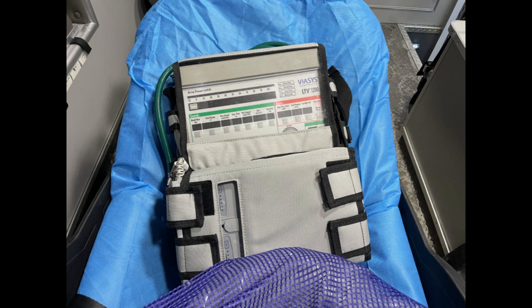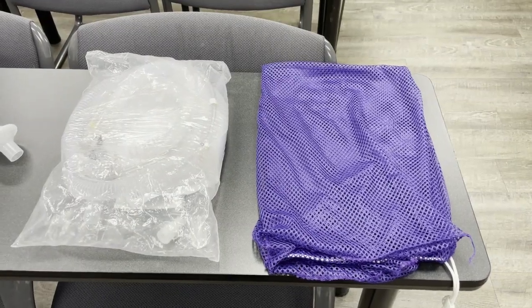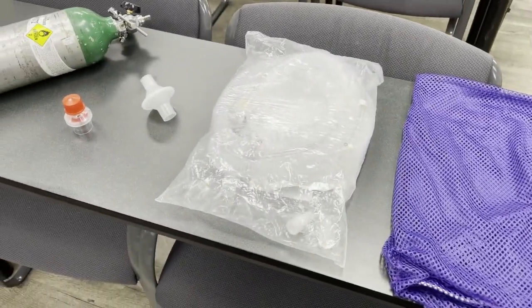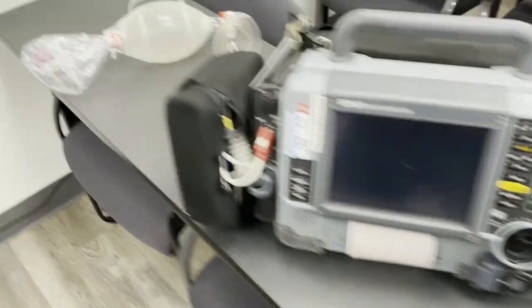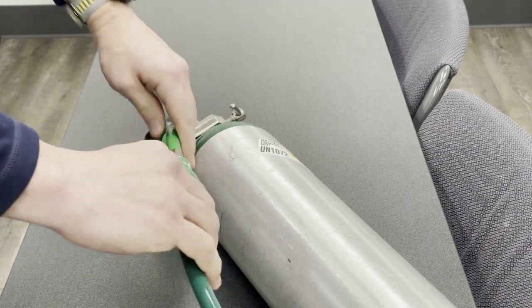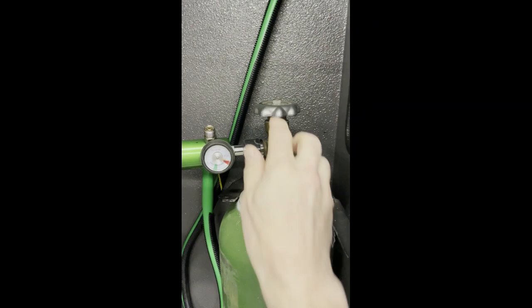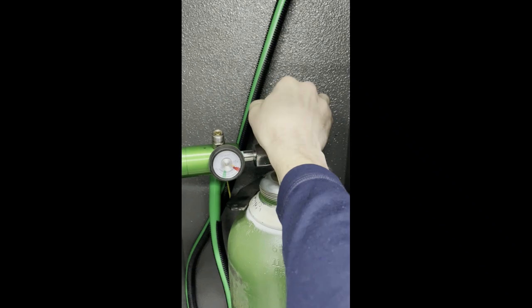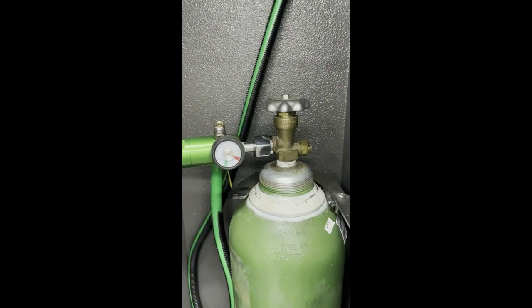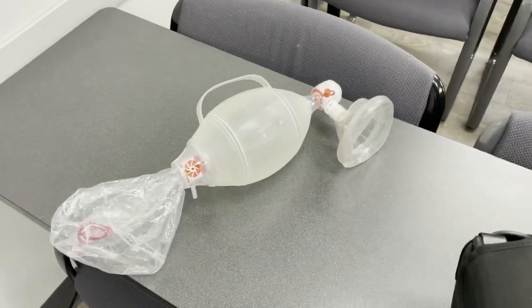Equipment needed at bedside: your LTV 1200 mechanical ventilator. From your purple vent bag you will retrieve a vent circuit and HEPA filter. Your heart monitor. A full portable oxygen tank with a quick connect pigtail. Make sure to open the valve on your main oxygen tank so it will be ready when you load the patient up and switch sources. Don't forget a bag valve mask just in case.